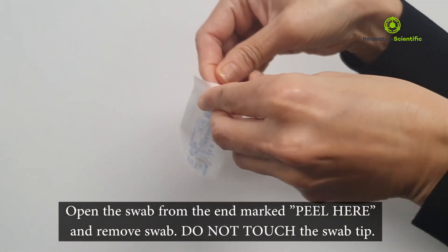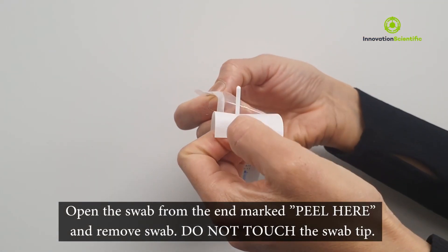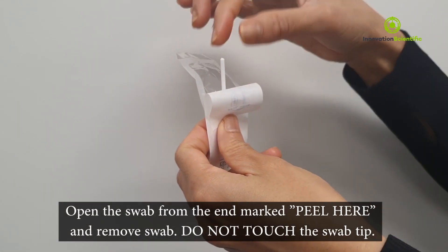Open the swab from the end marked 'Peel here' and remove the swab. Do not touch the swab tip.